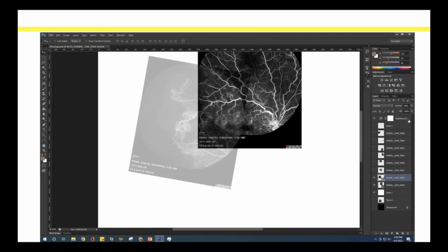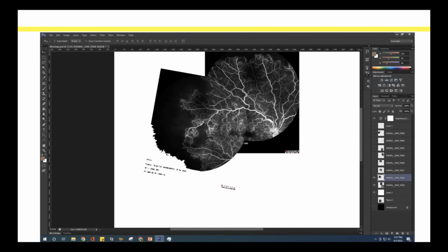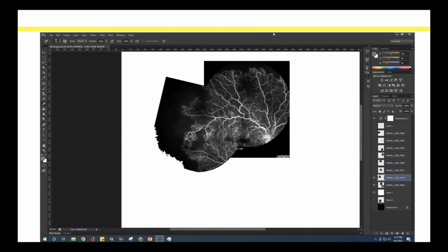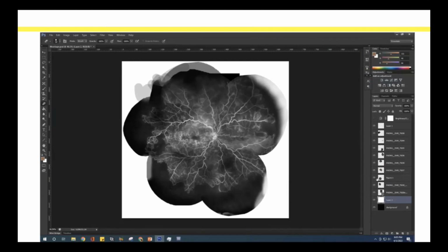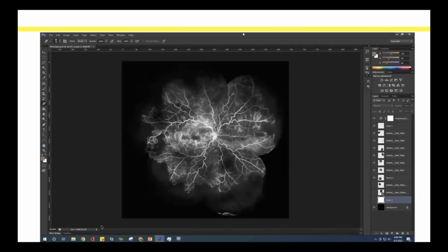So we want to create a montage view of the multiple sections of photographs to make the image more visually striking. One common thing that we need is the image should be visually striking to get it out on the cover images. So all the images that you've seen outside were all cover images which were all visually striking. In FFA, you don't get visually striking unless you do a montage like this, and you would predominantly need to collage all the images. And once you do the collage, so this was done by Photoshop, but with the prompting mechanisms today, this is something you can do very, very easily.